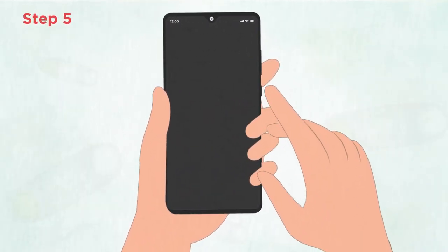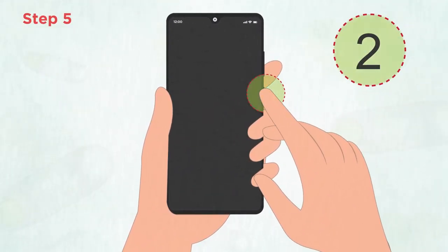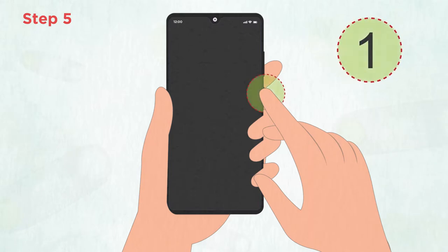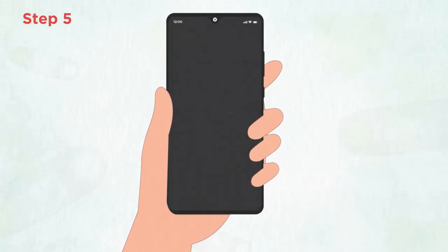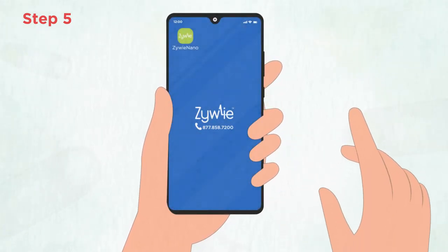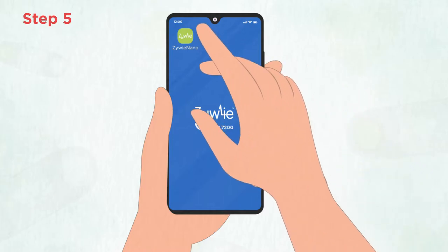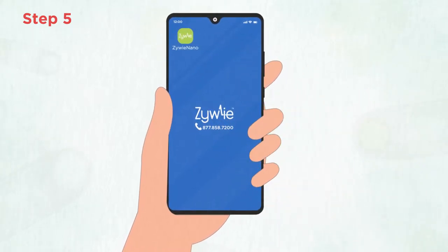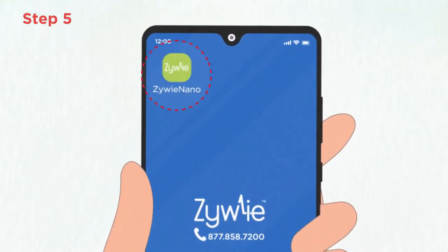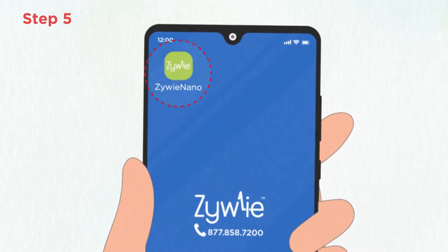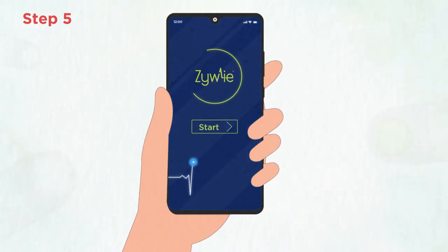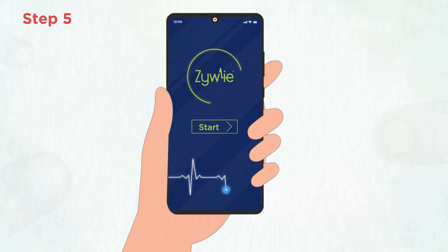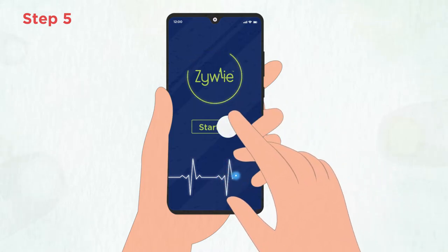Turn on the phone by holding down the power button for three seconds. It's typically located on the right side of the phone. Once booted up, select the green Zywi Nano app located in the top left-hand corner of the screen and follow the prompts. Please give it two minutes to fully boot up before attempting to start the study.